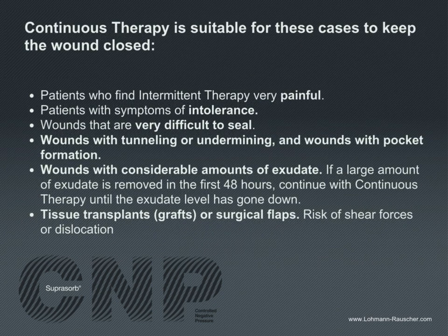Continuous therapy is suitable for these cases to keep the wound closed. 1. Patients who find intermittent therapy very painful. 2. Patients with symptoms of intolerance. 3. Wounds that are very difficult to seal. 4. Wounds with tunneling or undermining, and wounds with pocket formation. 5. Wounds with considerable amounts of exudate.